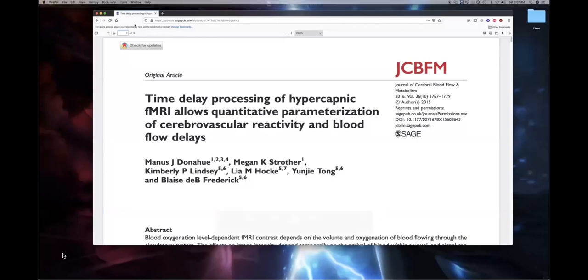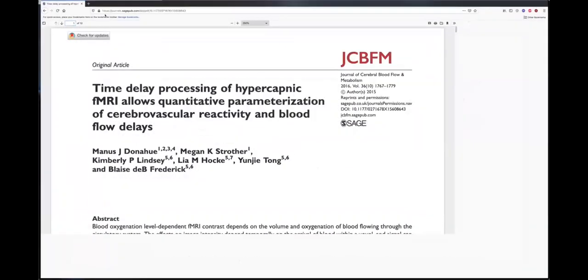You've heard from Ioannis how to run RapidTide, how to denoise signals, and how to look at the relevant output for denoising. Here I expand a little bit on the use of RapidTide in clinical data, using an example of the paper on Moyamoya patients, which you see here. We have the scan prior to intervention as well as after surgical intervention or revascularization.